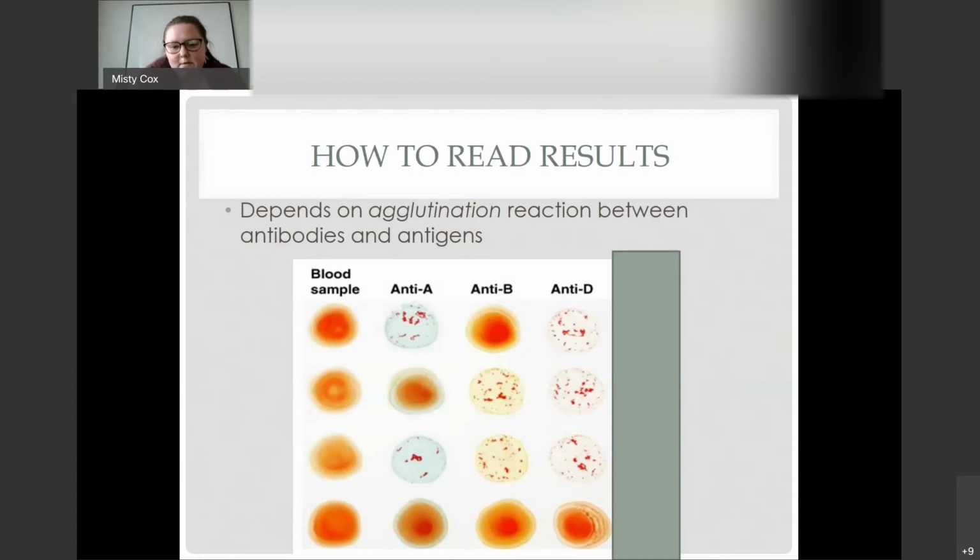So what about the second row? Put in the chat, what do you think it is? Oh yes, a bunch of geniuses. Yes, B positive, because there's clumping in B and there's clumping in D, so it's B positive. What about the third row?